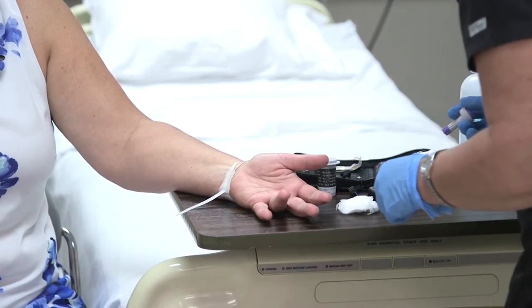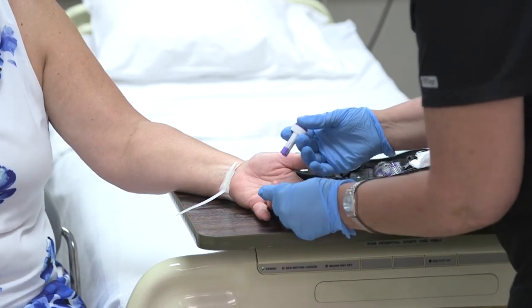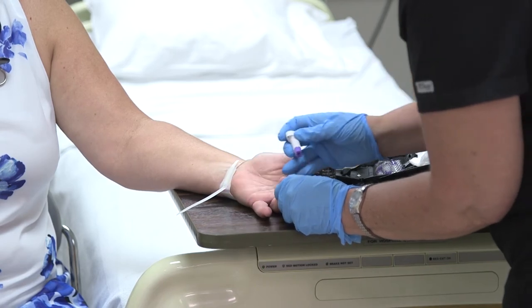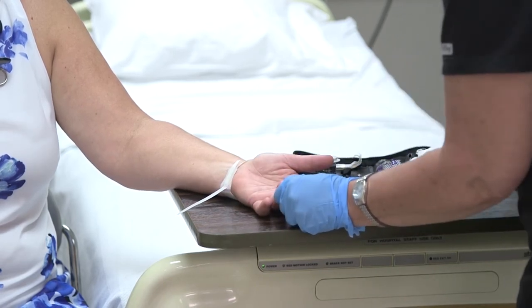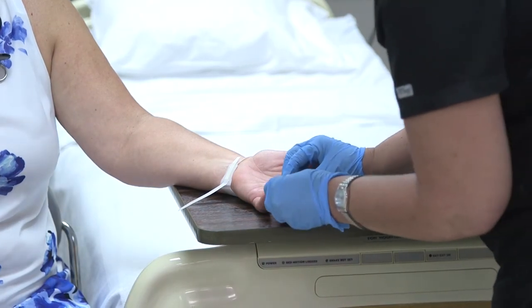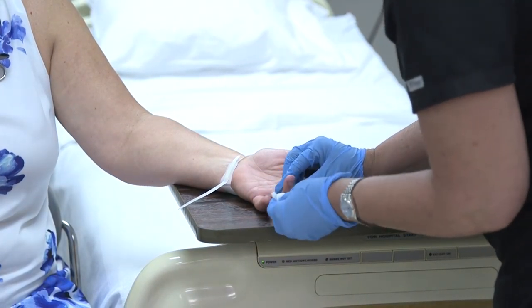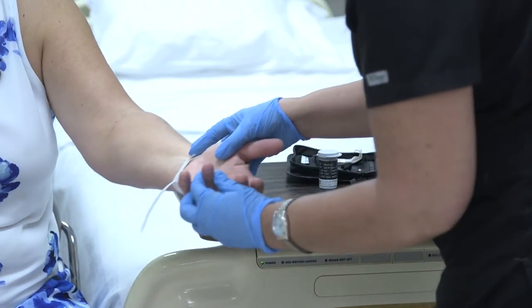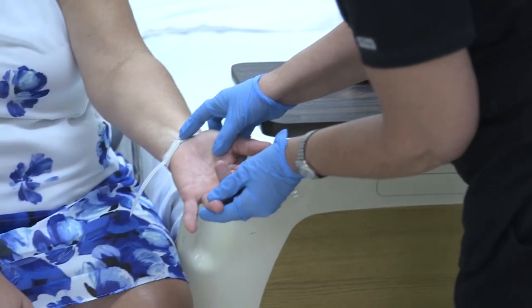It looks like it's good and dry. We're going to puncture on the side. Did you feel that? Just a little bit — just a little poke. We're going to go ahead and wipe off this first drop of blood, and I'm going to set that over there. Now I'm just going to hold your hand down in a dependent position.